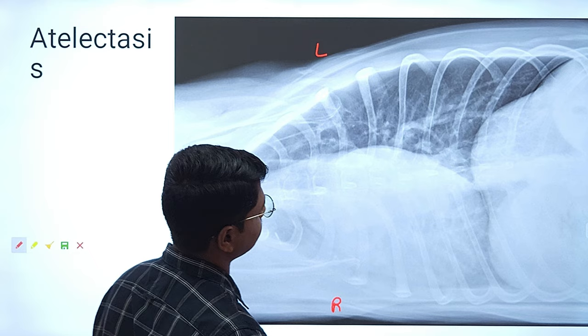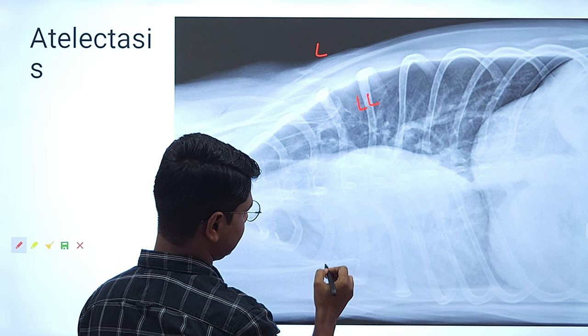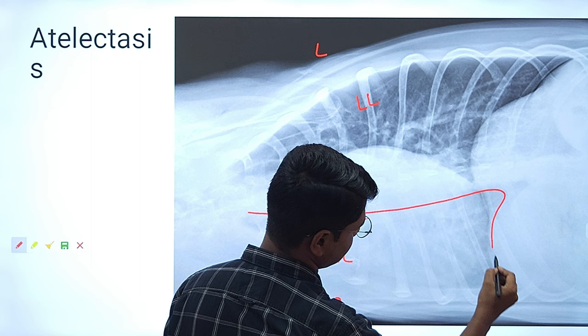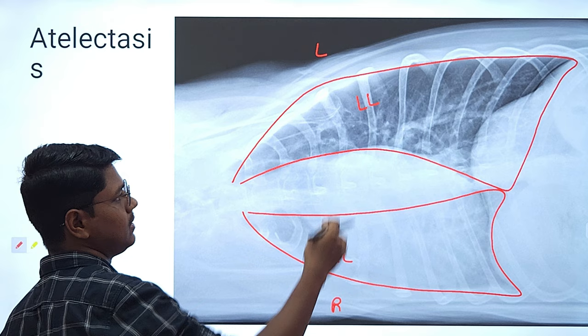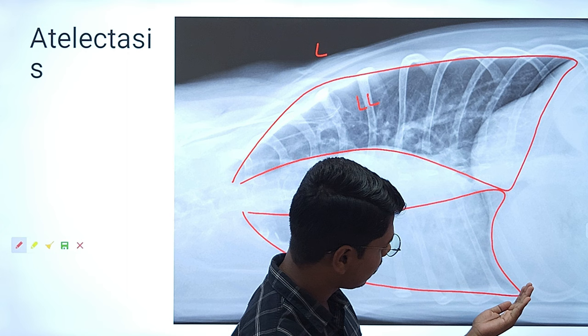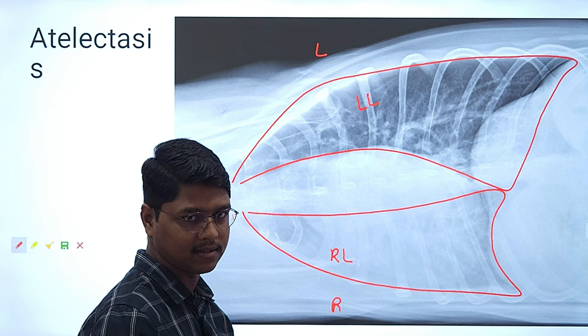See here — this is the left lung and this is the right lung. Look at the extent of the right lung. Can you see how well aerated the left lung is in comparison to the right lung? The volume of the right lung is comparatively less than the left lung. You can say this lung is atelectatic, or you can say the lung is collapsed.